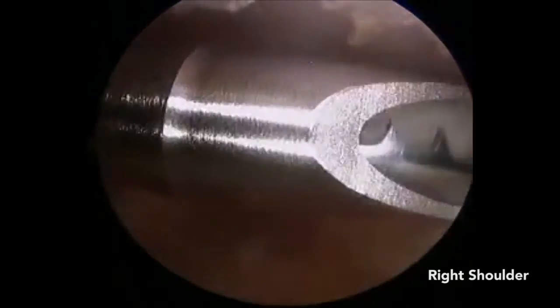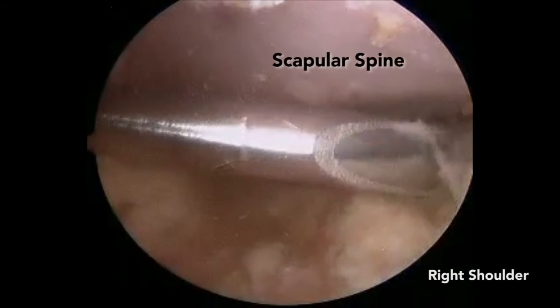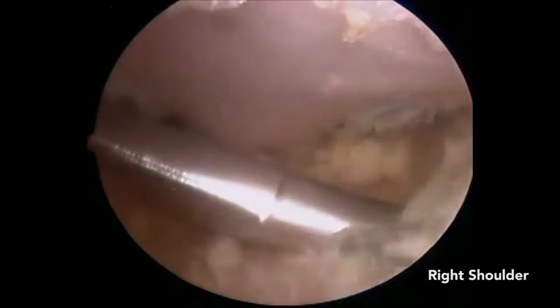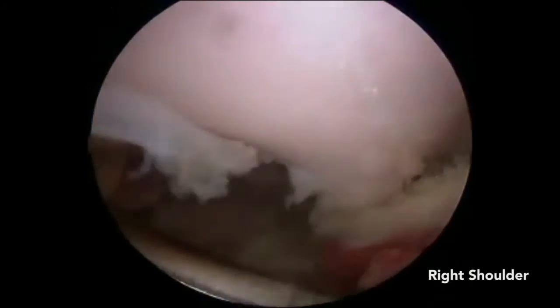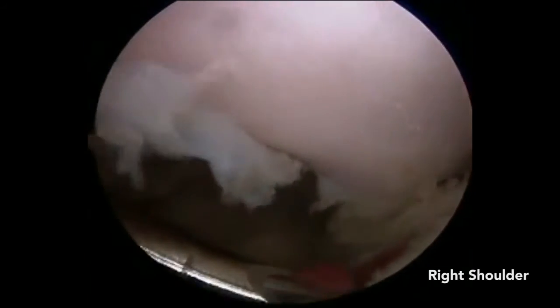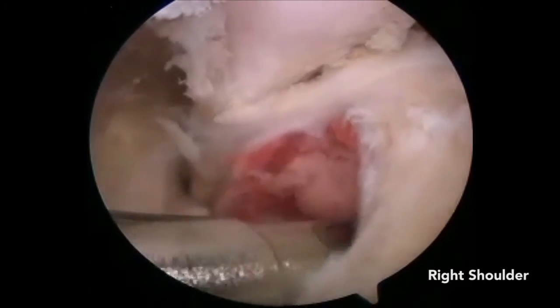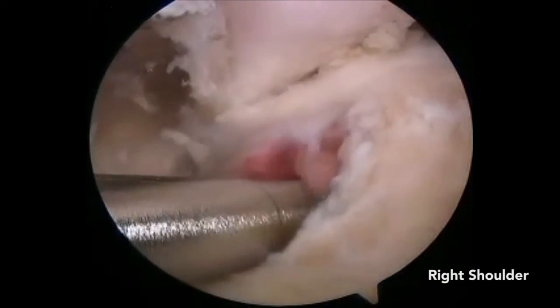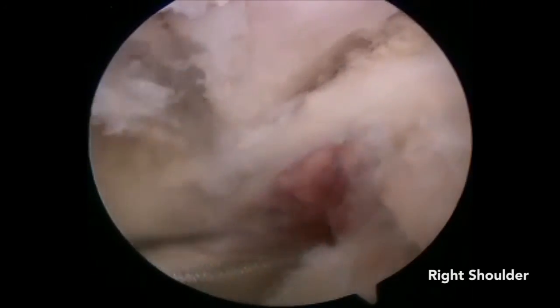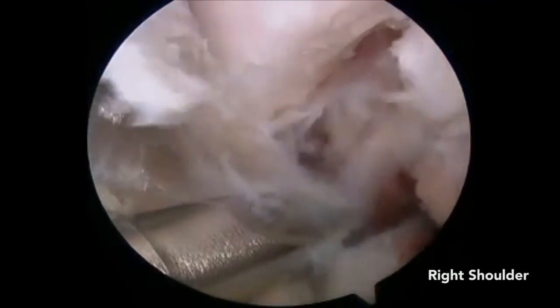Viewing through the lateral portal, a mechanical shaver is introduced through the posterior portal to debride bursa and any adhesions. The scapular spine is a consistent landmark that can be used for reorientation. Cyst material may be encountered in the case of a spinoglenoid notch cyst; once encountered and entered, the cyst is completely debrided using a mechanical shaver.